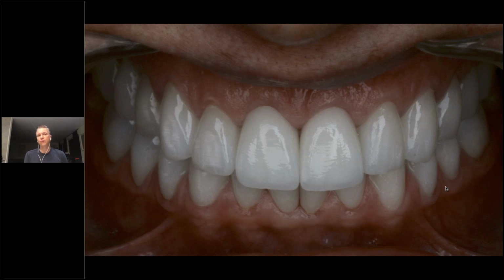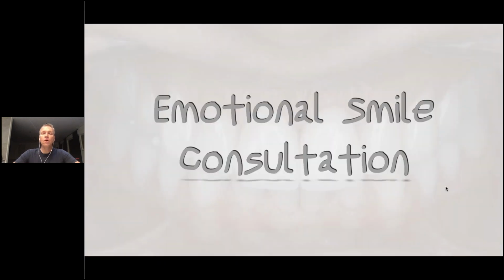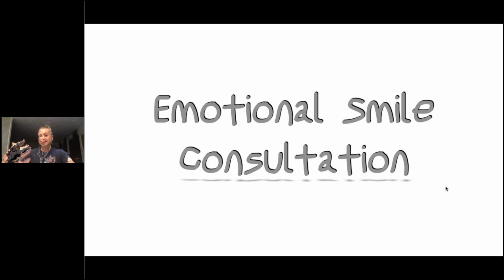That's where we are looking very, very strongly, to keep control from the day we start a case digitally to the day we finish the case and it goes to the patient's mouth, to have that control in the treatment team. Very, very important.